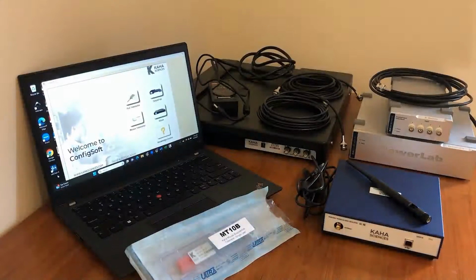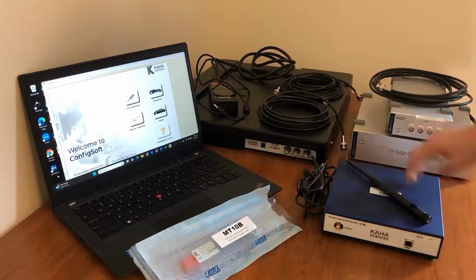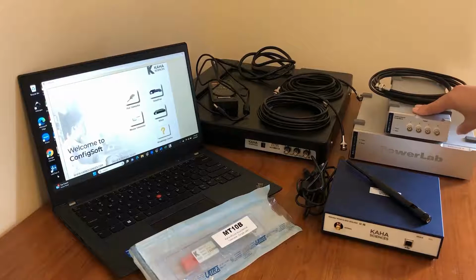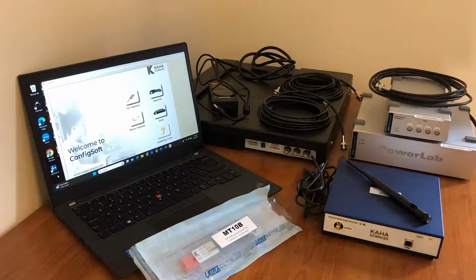Hi everyone! In this first video, I will be showing you the basic steps of how to set up the Kaha Telemetry system. Now as you can see, I have the three main components of the mouse system laid out in front of me, including the mouse biopotential telemeter, the configurator, and the mouse tBase. If you are using RATs, these initial steps will be the exact same to set up your RAT system. And of course, to complete your setup, you will need a data acquisition system such as a PowerLab C and the instrument interface I have here, and a laptop or desktop computer.